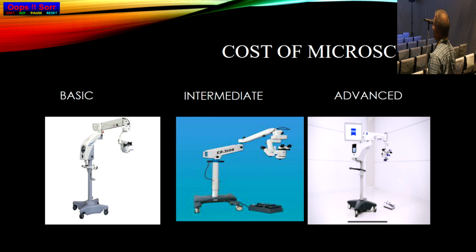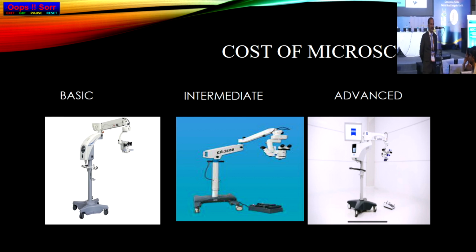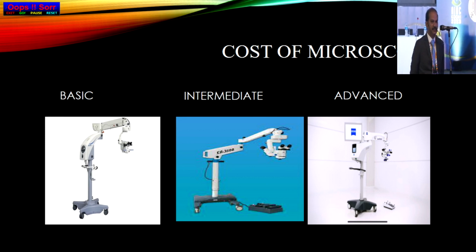So should I go for OmniGlow, or should I purchase a new microscope like a Topcon or something like that? Sir, if your Takagi is actually working well, if the illumination is good, if there are no maintenance issues, if the optics are perfectly maintained, you have tiltable optics, you have an XYZ zoom, don't go for a newer one, sir. It's better to invest in an OmniGlow and then go ahead with this procedure. Thank you, sir. Okay, sir. There's one more question, ma'am.